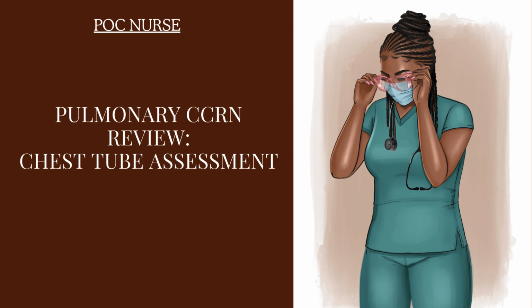The last complication we're going to talk about is if the drainage unit tips over. By drainage unit, I mean the drainage box, your Pleurovac. If your Pleurovac tips over, now all the fluid has gone all over the place. It's happened to me once. You don't know where anything is. You don't know how much fluid has drained out over whatever time.